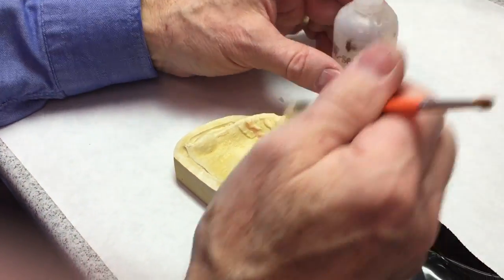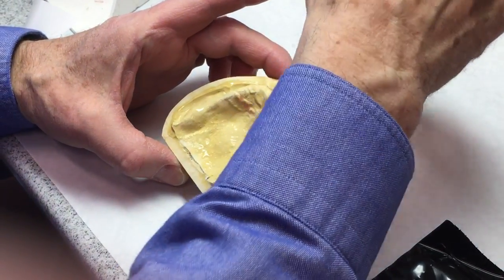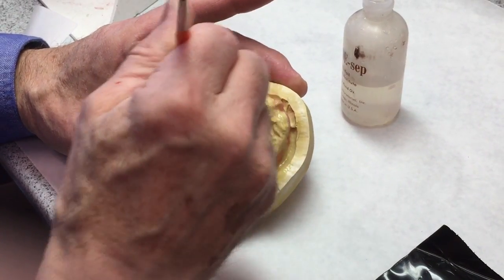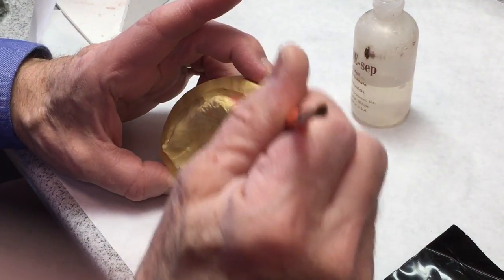I have to put some separator on because otherwise the triad that we're going to make this out of is going to stick to the stone and pull off patches of stone, which will result in a denture that's going to cause sore spots. This CoSep needs to be wet when you apply the triad, so I want to use a brush to make sure I get it everywhere.